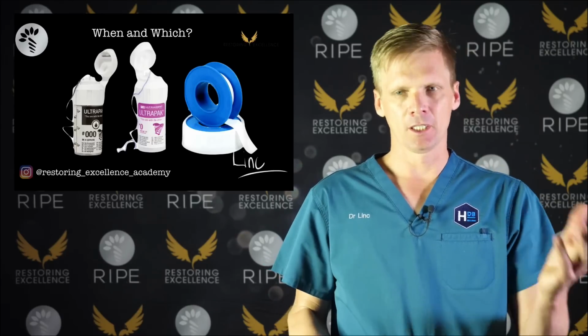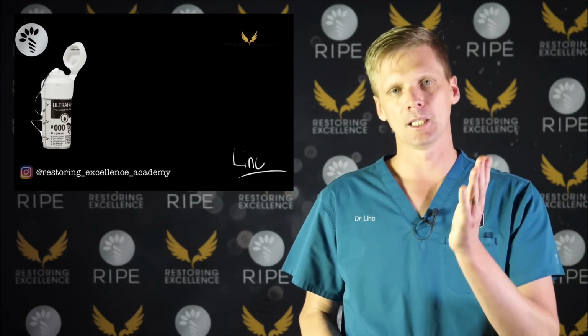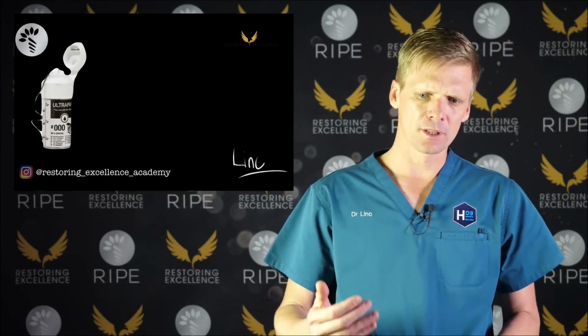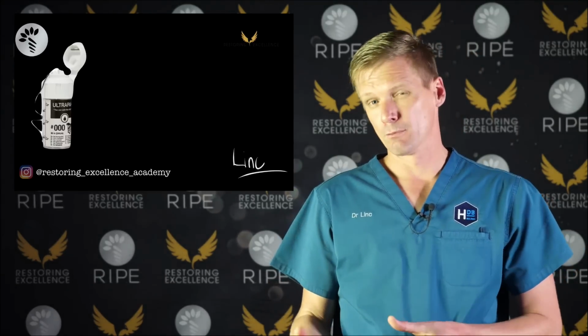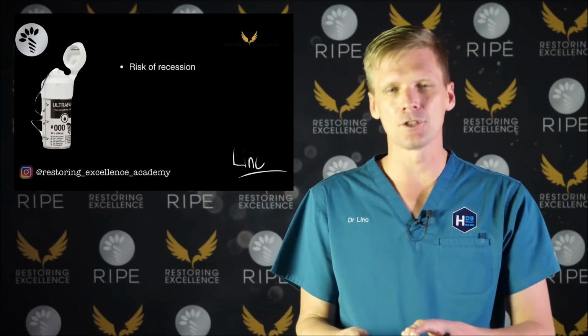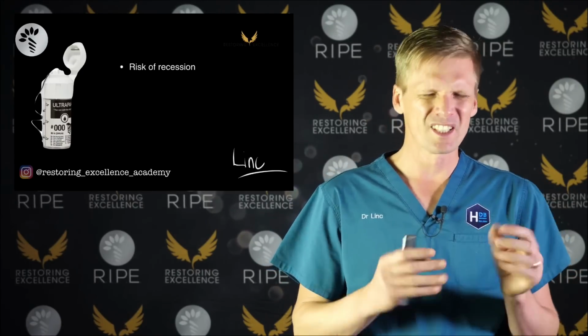The 000, I only use 000 and 0. So the black cord and the purple cord from UltraPack. If I'm doing a core build-up, I will use the thin cord where there's a risk of recession, because I don't want to go packing thick cords when there's very thin tissue, because it will recede. I'll use it for where there's just a little bit of bleeding.